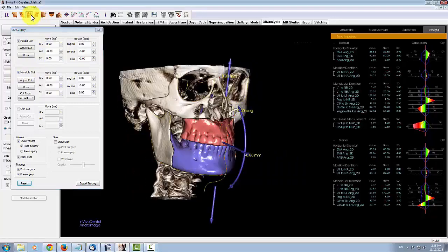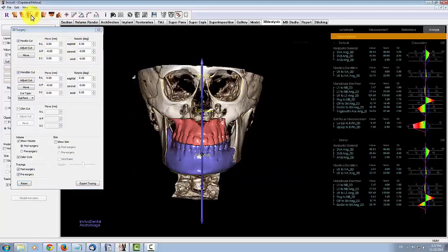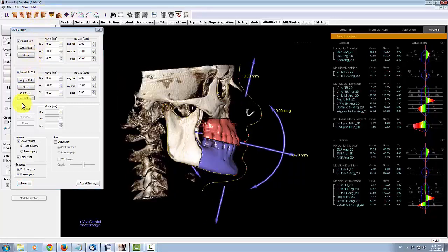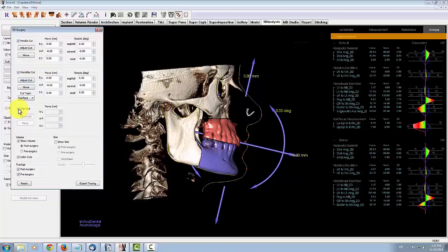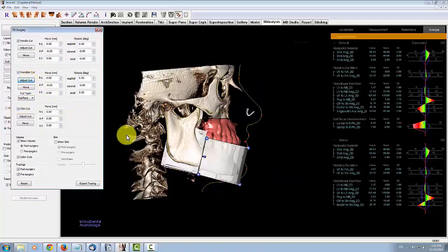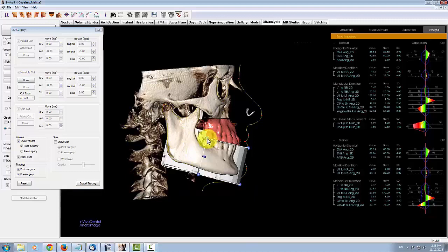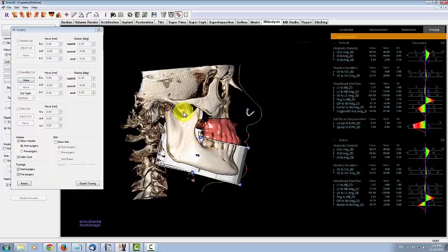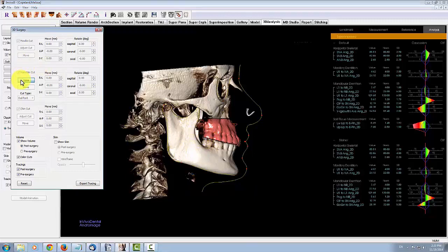Notice that the chin cut requires the mandible cut to be active first. Once you have enabled a cut, you can make adjustments to the automatically generated cut by clicking on the Adjust Cut button and dragging the control points into position. Cuts are performed where the volume intersects the translucent planes.